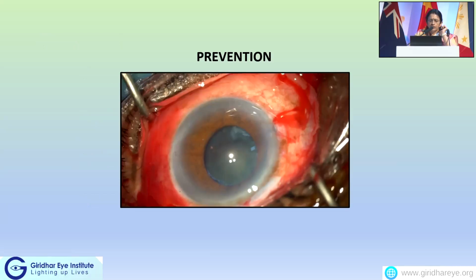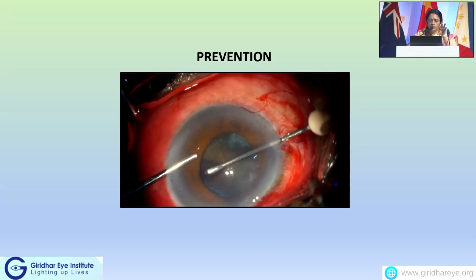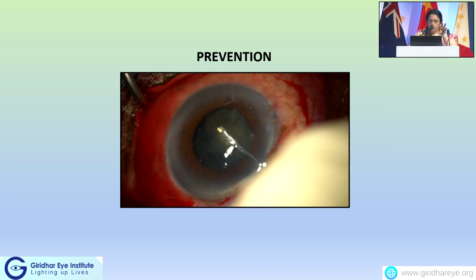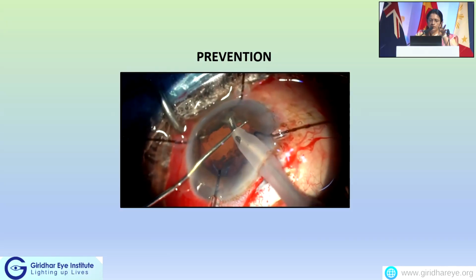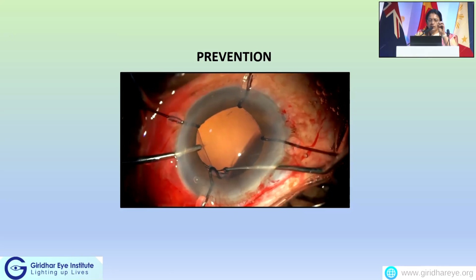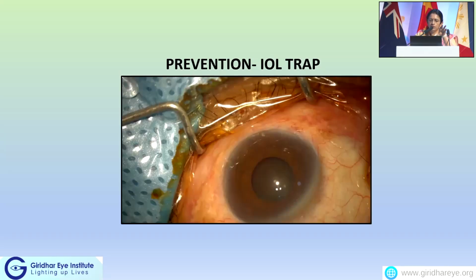Now, in this patient, he had pseudoexfoliation, and there was an increased gap between the iris and the cataract, indicating some zonular weakness. And as you can see here, when the rhexis was initiated, the entire lens-bag complex was moving, suggestive of zonular weakness. The lens was nudged after hydrodissection, and the capsular rhexis came to the center. That again points to zonular weakness, and the entire capsular bag was shaking during emulsification. I had to keep this Sinskey hook behind the phaco probe to prevent aspiration. So identifying these signs of zonular weakness intraoperatively is important so that we can take proper precautions and prevent the occurrence of capsular phimosis and decentration of the IOL.